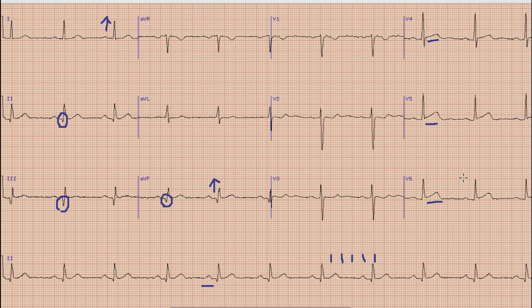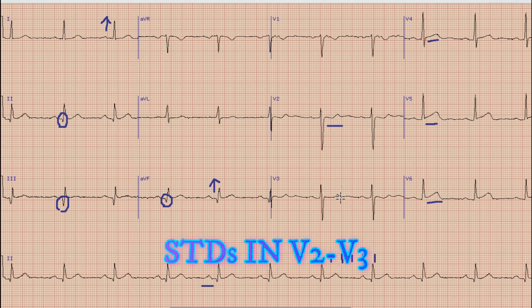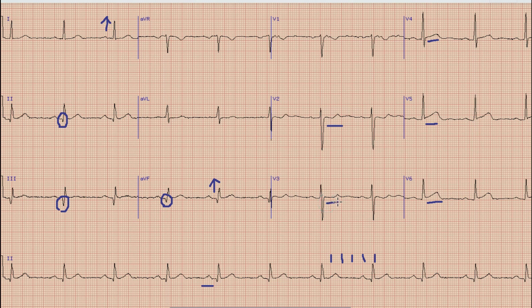Secondly, if you can see especially in leads V2 and V3, there is about 0.5 mm ST sagging. The presence of ST sagging is because of reciprocal changes — reciprocal changes as a result of ST elevation in the lateral leads.